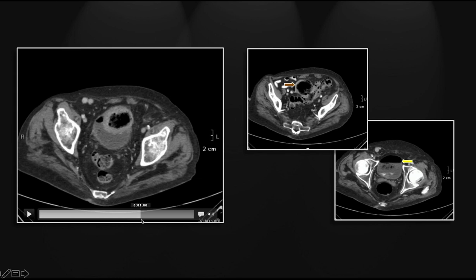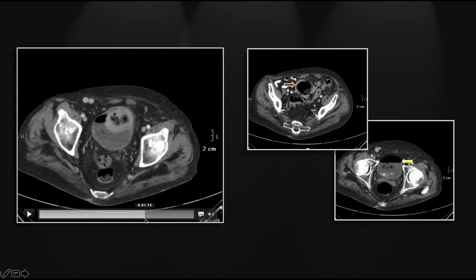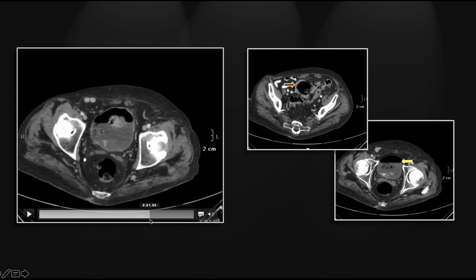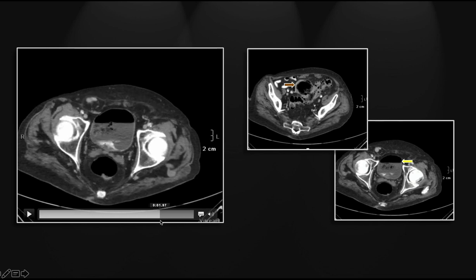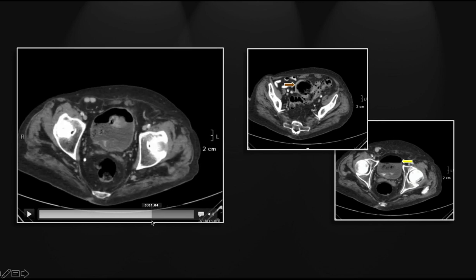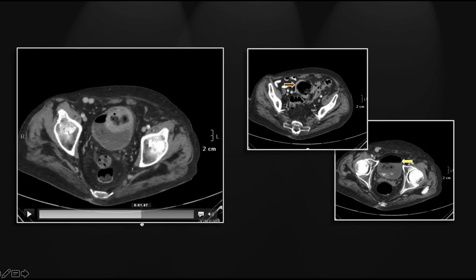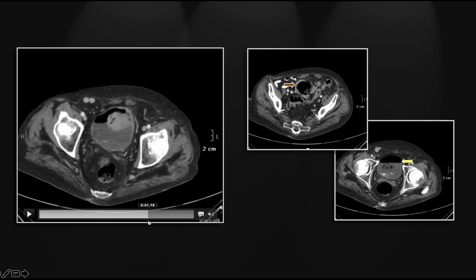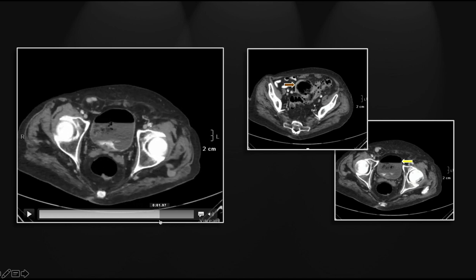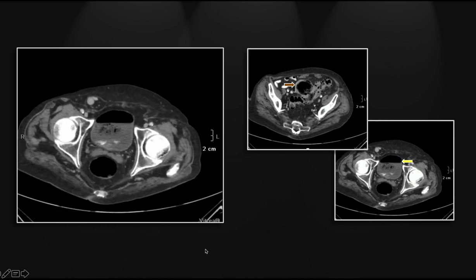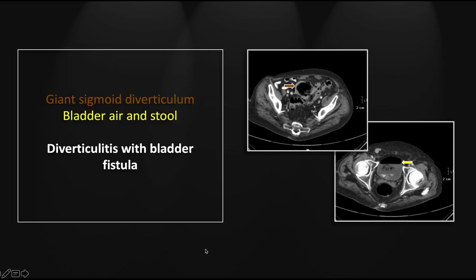Inferiorly, you can see that it is compressing the dome of the bladder, and here is the small communication between the two where you can see stool passing from the colonic diverticulum into the bladder. So that is a case of giant diverticulitis with an associated bladder fistula.